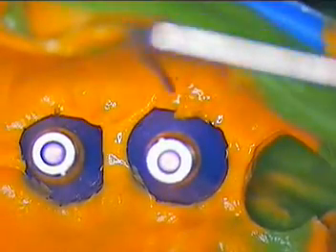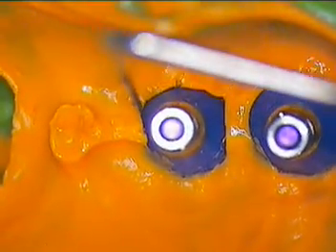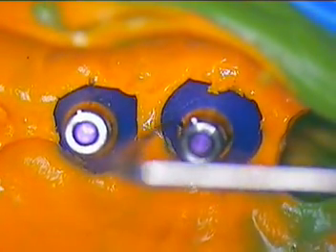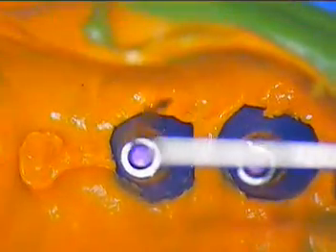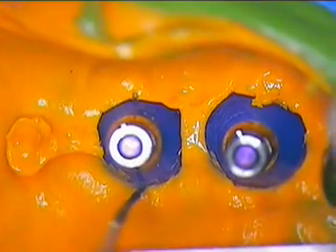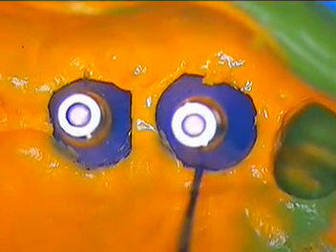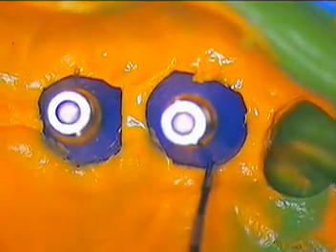So all that will be transferred directly to the model. I think what's hanging a lot of dentists up is trying to get this tissue replicated from the bone level implant cases and getting it transferred identically to the stone model and then back with the custom abutments that are made. I'm going to try to show you in the next segment what this all looks like on the model.